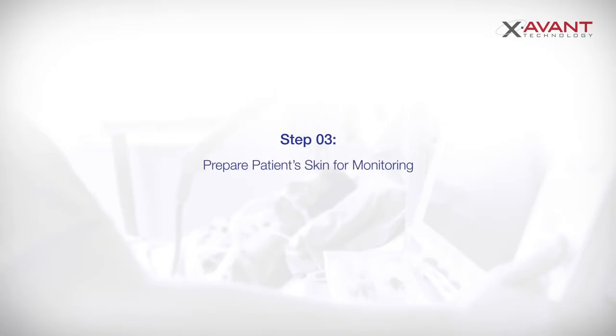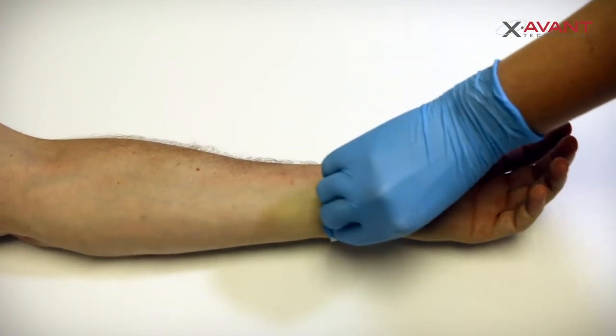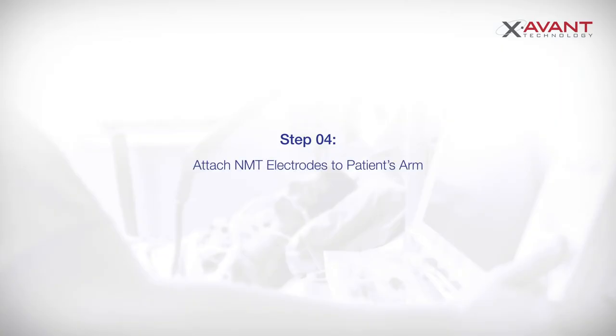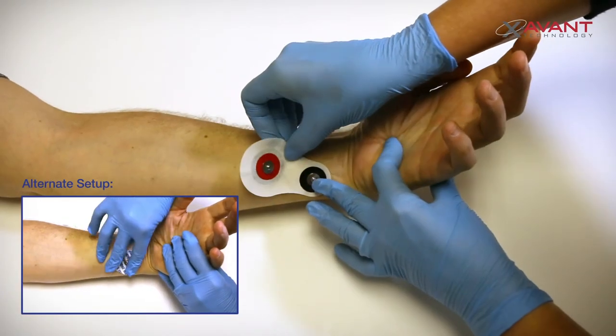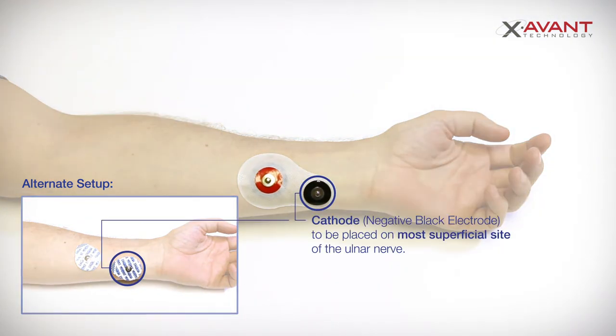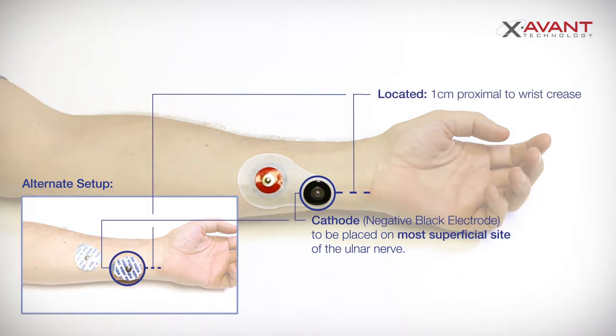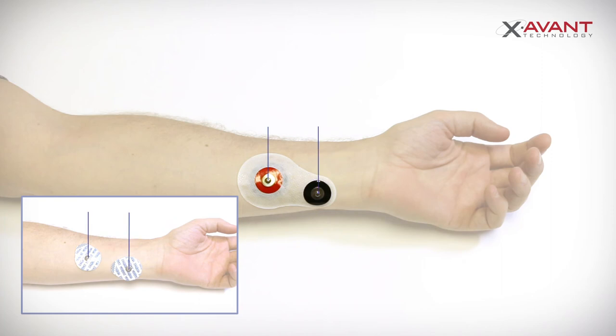Properly clean the patient's skin area before attaching the stimulation electrodes. Securely attach the stimulation electrodes to the patient's arm. The cathode or negative black electrode is placed on the most superficial aspect of the ulnar nerve, usually located one centimeter proximal to the wrist crease on the radial side of flexor carpi ulnaris. The anode or positive red electrode is placed proximally on the volar forearm. The distance between the two electrodes should be a minimum of two to three centimeters.